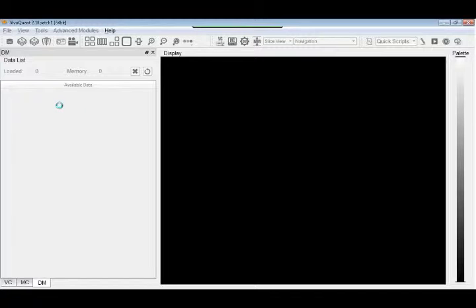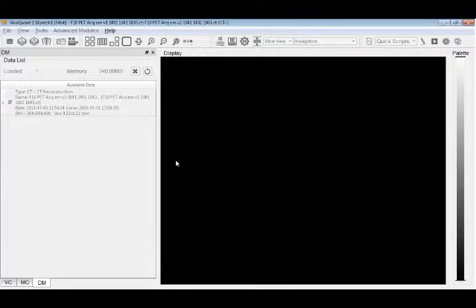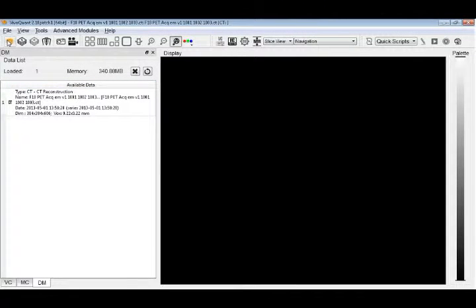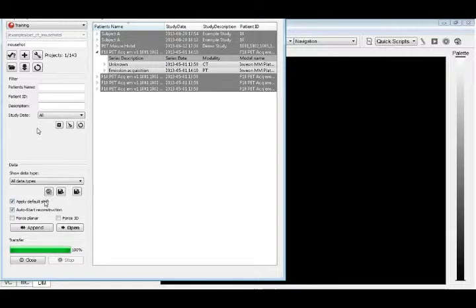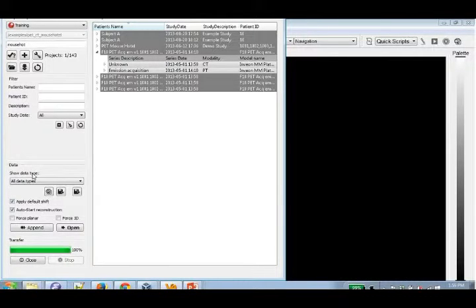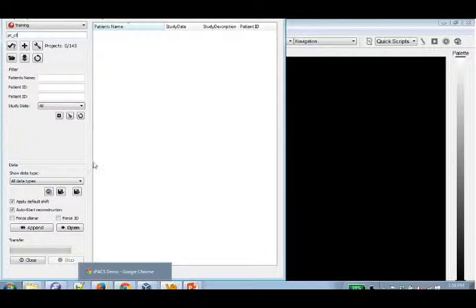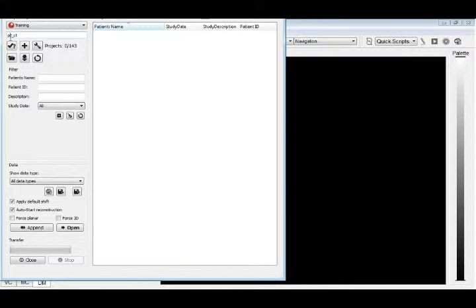I think we chose some really big ones. Yeah, those are the automatic ones. Oh, there we go. Oh, did I? Was it for plan? Oh. So what happens if you try to open the projection data along with the volume layer, and then? Oh, should I do the other? Okay. I think it was P, CT_PET.